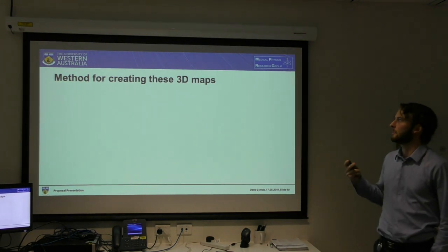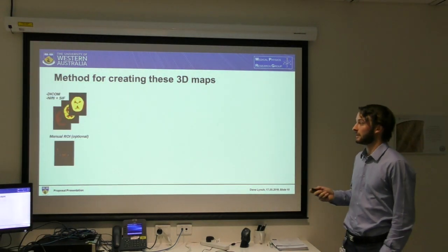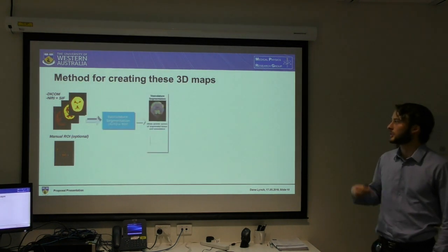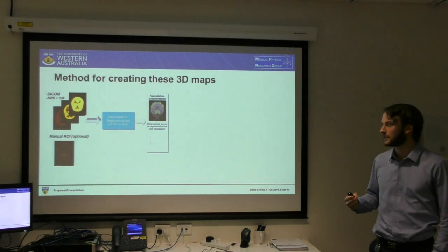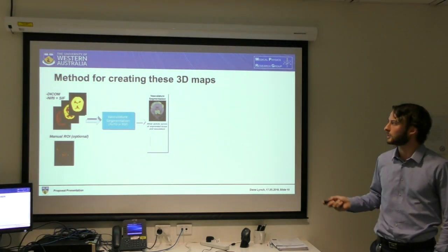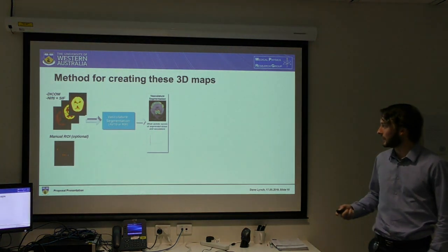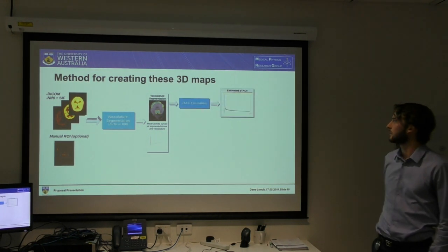How do I then create the maps from these parameters? So we're taking each of the images at different times. We're going to segment where the artery or vein of interest is. It's either going to be the carotid artery or the superior sagittal sinus vein, which is actually what the picture was before. Once we segment where the vein is, we can look at the concentration within that region, and form these plasma time activity curves.